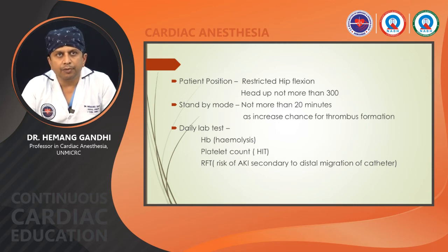And daily we need hemoglobin monitoring to check for hemolysis, platelet count for HIT, and also renal function to check for any catheter migration leading to AKI or not.